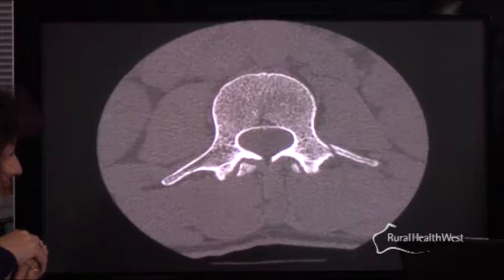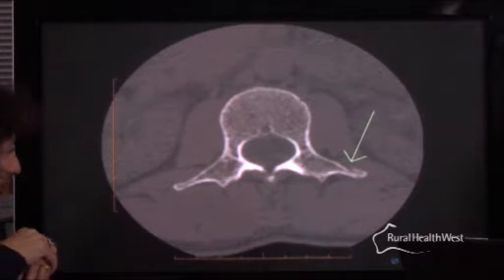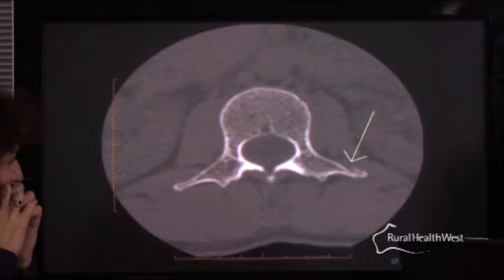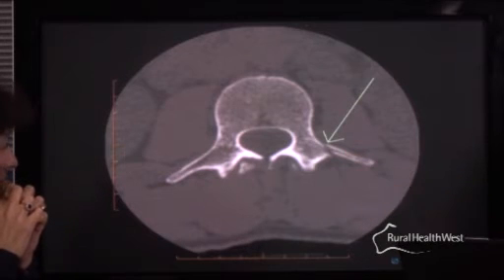The importance of the history is that if you know that that's where they're sore, then you will look at those lines with a more jaundiced view, and you may well suggest that we do more. Or truthfully, perhaps we should have just started with CT, but certainly you'd want to go on and do a CT. So we did this in this patient, and you can see on the left side where we were concerned that there may have been something that, yes, at L2 there was a fracture of the transverse process. At L3 there's another fracture of the transverse process with mild displacement, and at L4 there's another undisplaced fracture.